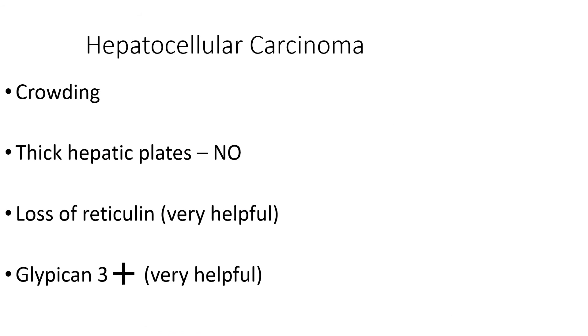But that important question: did the control work? Yes, it did. And by Jove — look at that glypican-3: it is diffusely and strongly positive. Any naysayers? None. This is HCC, period. Tallying the evidence: crowding, definitely. Thickened hepatic plates — not there, but that's not uncommon, as many HCCs have a solid pattern. Loss of reticulin — incredibly helpful. Glypican-3 — the most helpful feature. There is no doubt this is hepatocellular carcinoma. The heaviest emphasis I generally place is on the H&E stain.